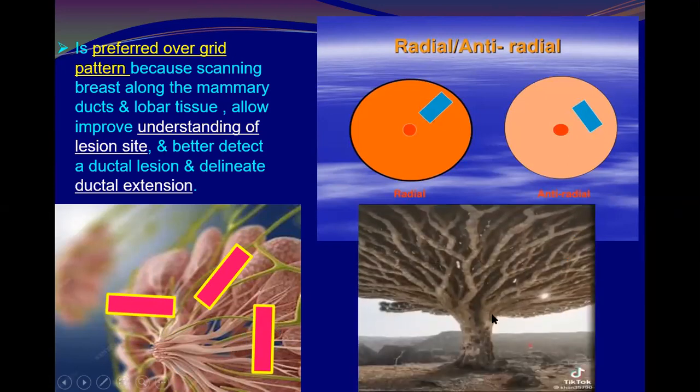And if you imagine these multiple ducts, large lactiferous ducts going toward the nipple like this tree.